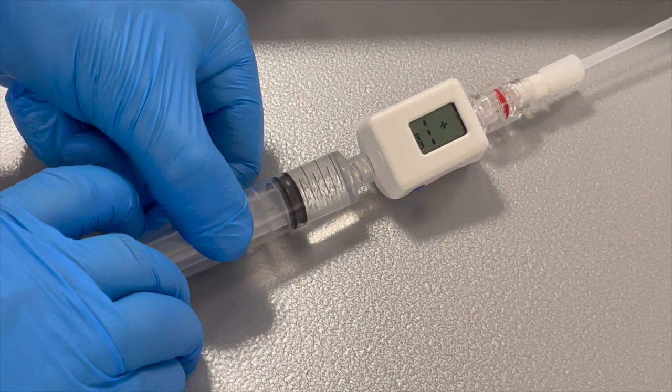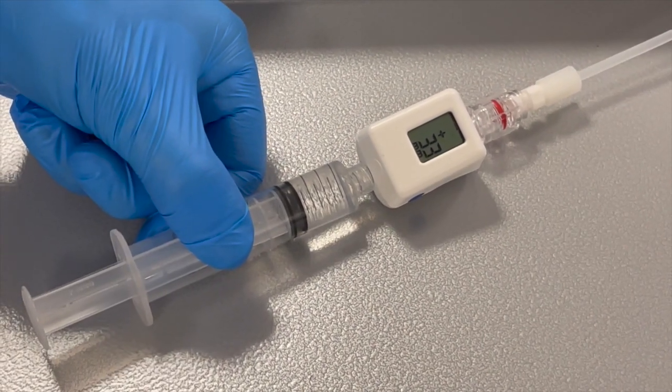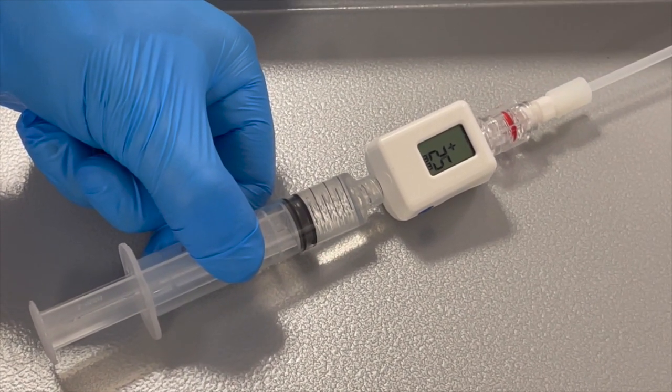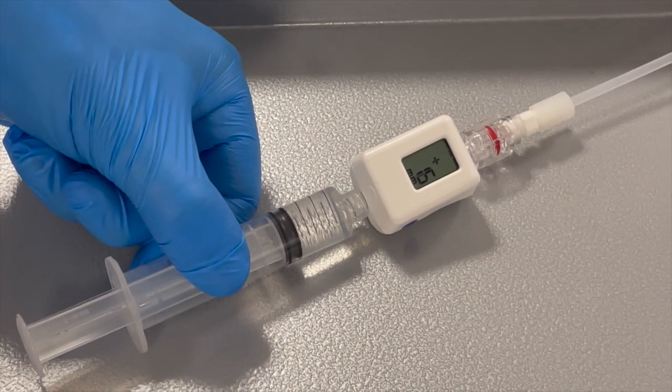This is a good opportunity to confirm the intravascular position of the needle tip, as flushed saline will be visible. The pressure readings of the manometer first rise when flushing and then will come to settle, and allow 60 seconds for this to happen. Repeat this process in total 3 times to help ensure consistency and use the average reading.